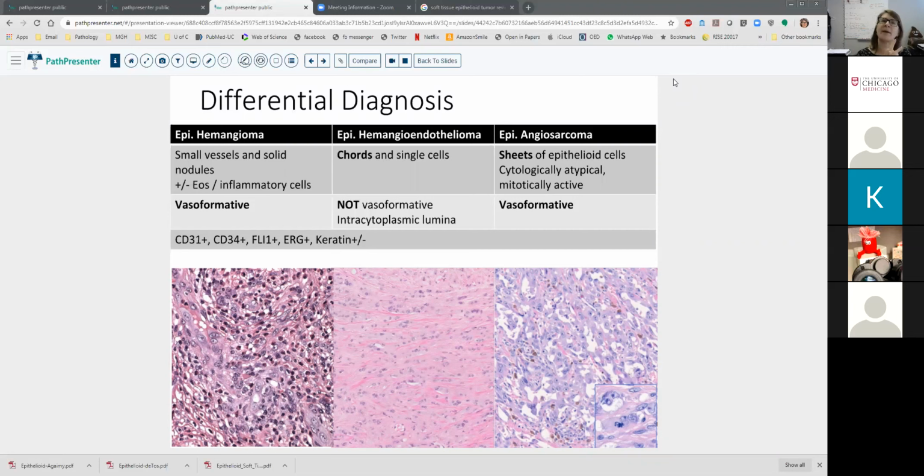The hemangioendotheliomas, if you've read the book, which it sounds like you have, come in so many shapes and forms: retiform, spindle cell, Kaposiform, epithelioid, and overlapping hybrid hemangioendotheliomas. So the most important thing is to convince yourself whether you think this is a benign hemangioma or something intermediate or malignant.